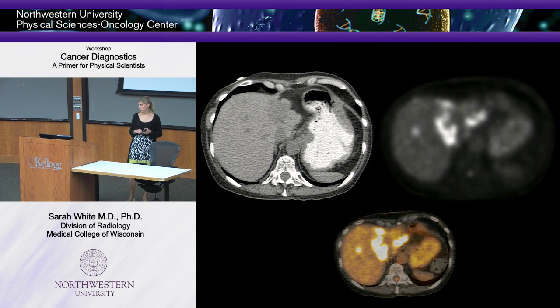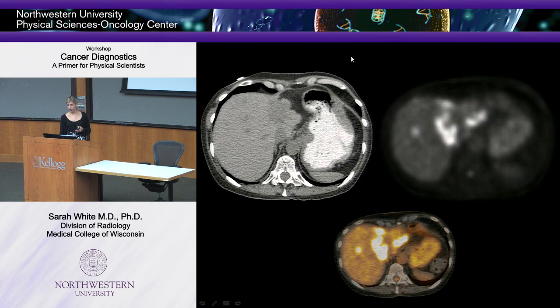So the oncologist said, this looks weird and it's getting bigger, whatever this weird thing is. So they got a PET scan. And this is what your PET scan looks like, okay? Sometimes we call it unclear medicine because we can't see what we're looking at. It's just a big smudge on the screen, okay?